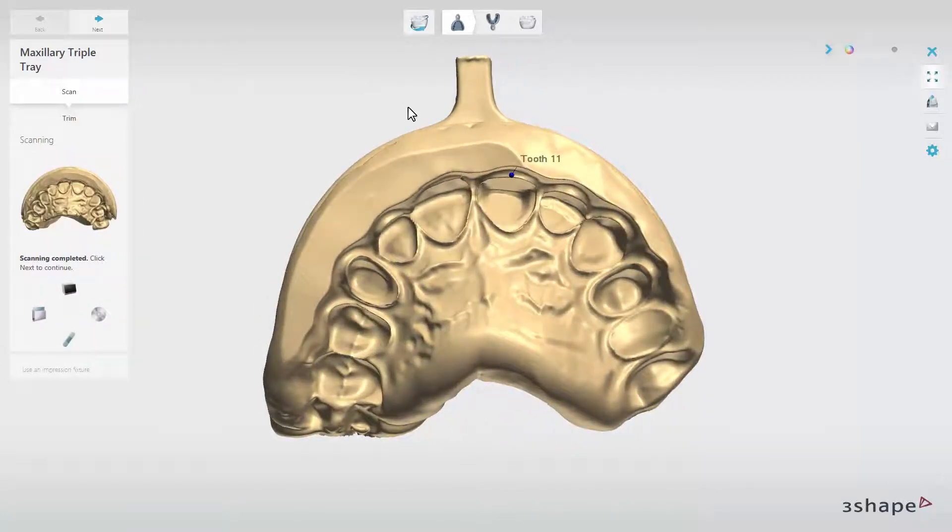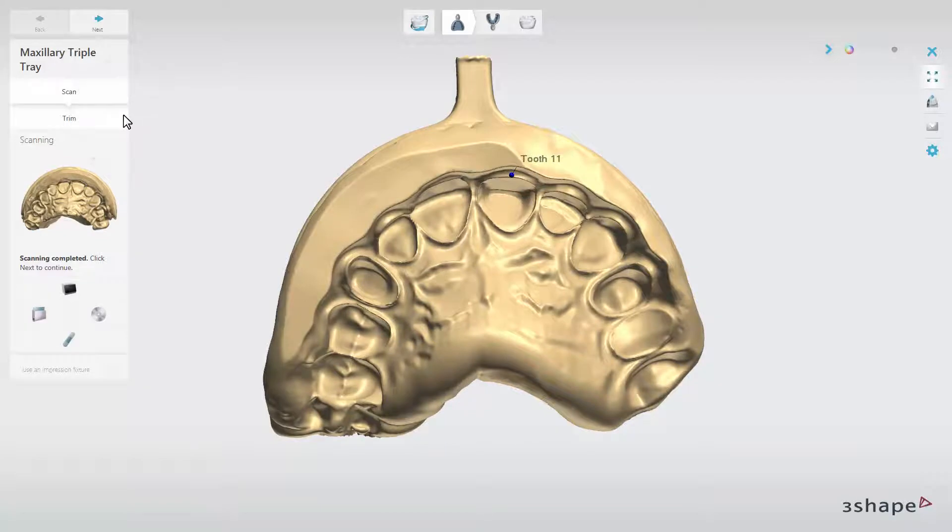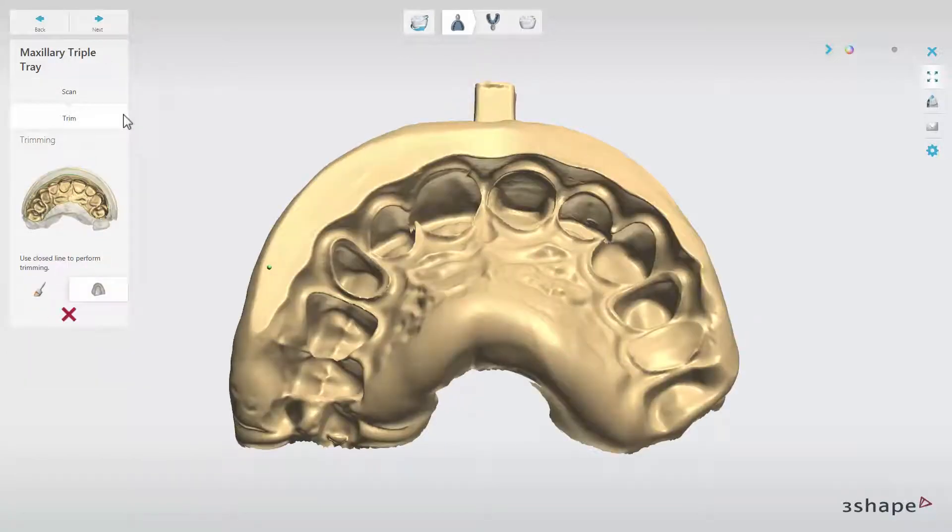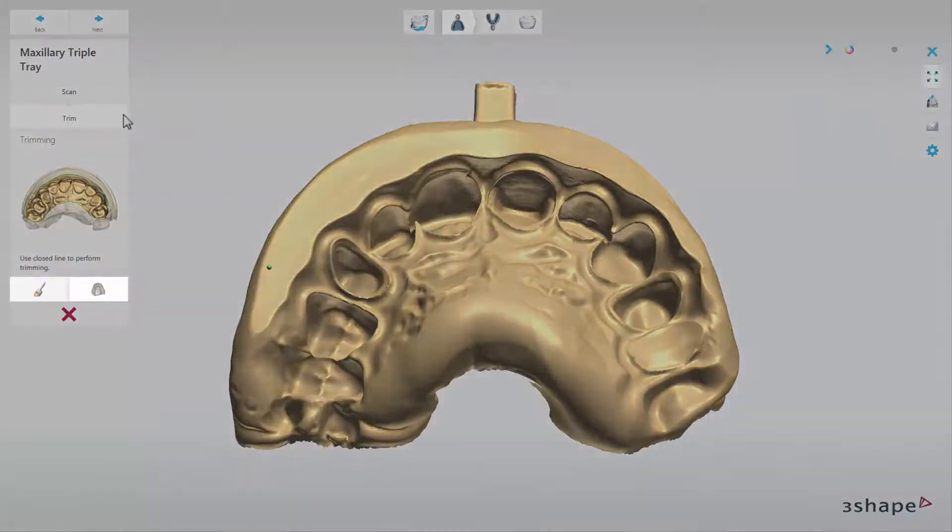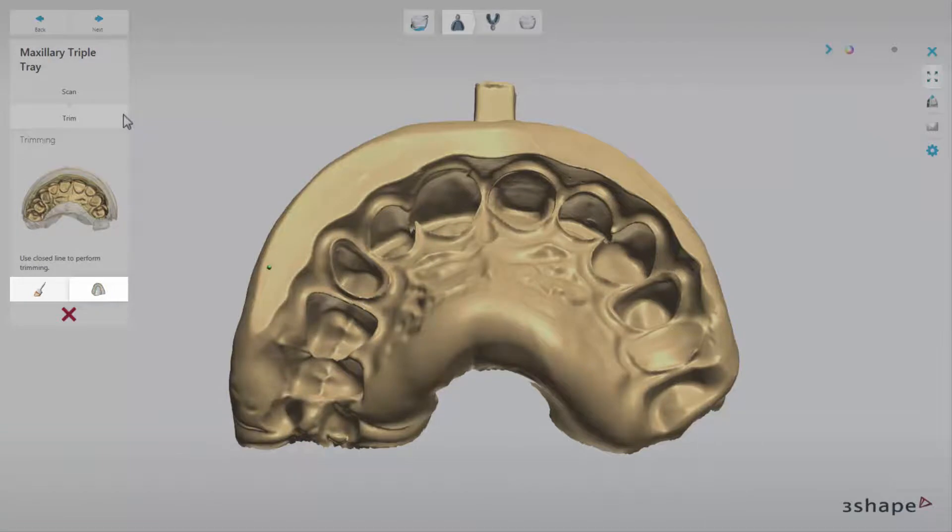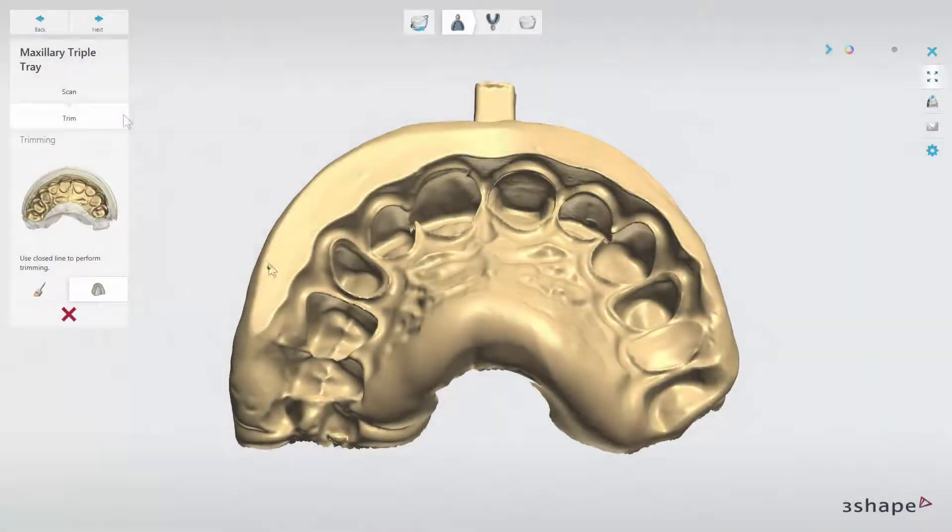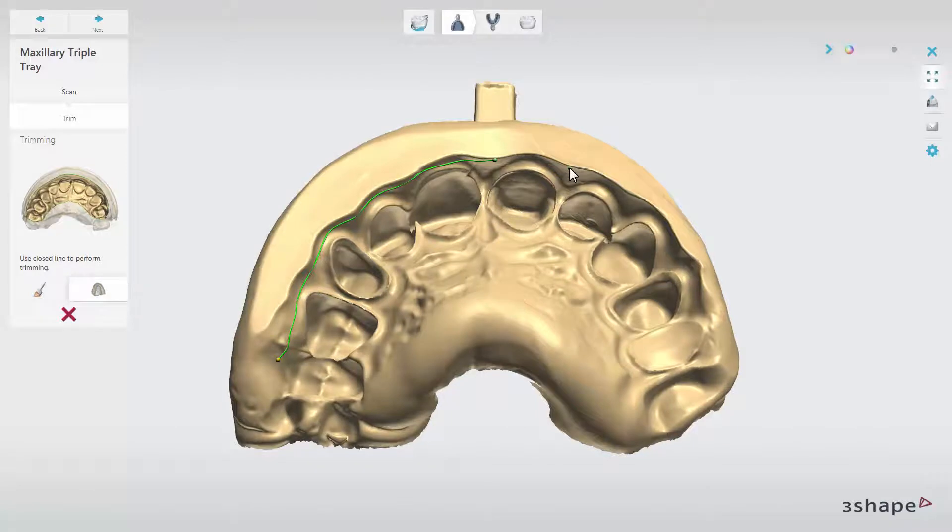When ready, you have the possibility to trim it to reduce the amount of data that will be carried over to dental system. Use either line mode for that or selection. If you are using line mode, just place points until you go around the whole desired area.